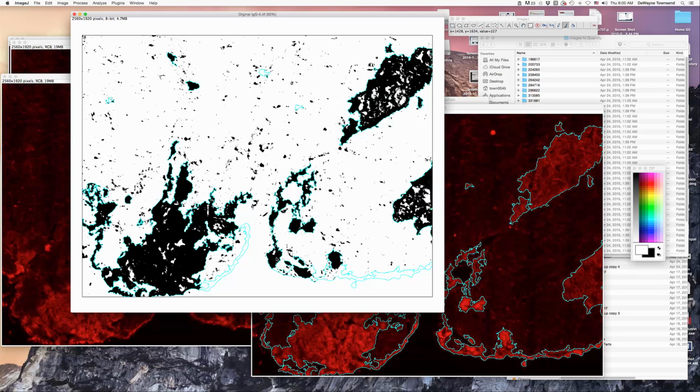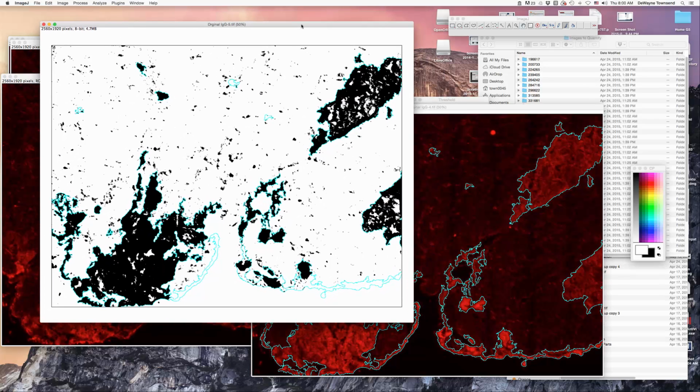So that positive area is right in here, so I'm going to get rid of this guy here, and then all of this down in here. So this is a little bit of a tedious process, but it will allow us to really have a good idea of what these lesions look like, which will be very important for us to understand how they're coming about and what it actually means.